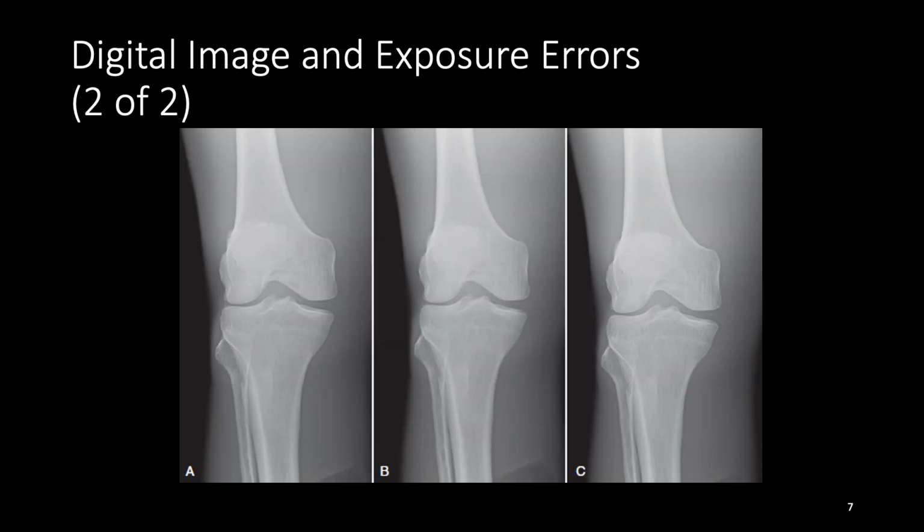If the mAs selected is too high, high exposure to the digital IR, the brightness can also be adjusted, but the patient will have received more radiation than necessary. The radiographer should be diligent in monitoring the EI values again to ensure that quality images are obtained with the lowest possible radiation dose to the patient. A radiographic image repeated because of insufficient or excessive exposure generally requires a change in mAs by a factor of at least 2. So again, we would be decreasing it by half or doubling it.